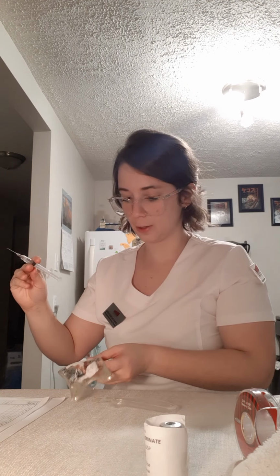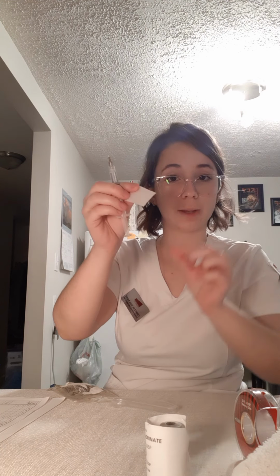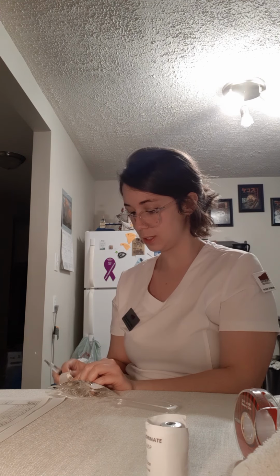Now, I'm going to inject that into my NaCl bag. So, I'm going to put the bag close to the end of the table, and I'm going to be very careful with the needle. I'm going to take my little wipe, and I'm going to wipe the end of it.